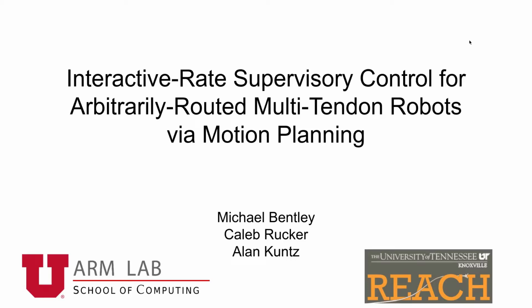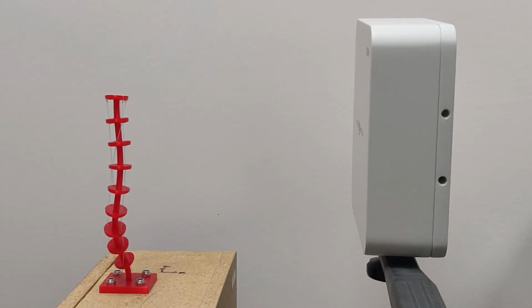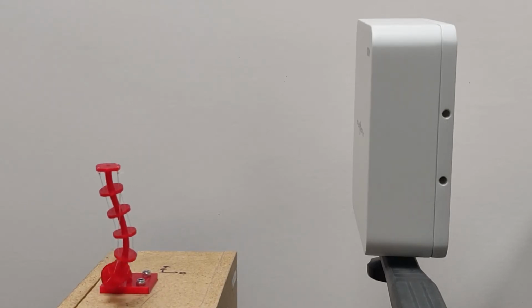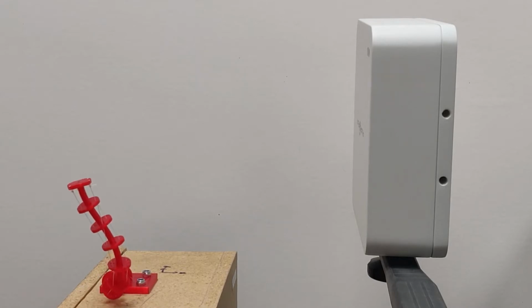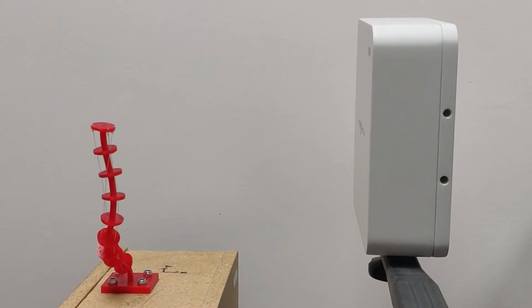This work is interactive rate supervisory control for arbitrarily routed multi-tendon robots via motion planning. This is a tendon-driven robot, a promising type of continuum robot. Tendon-driven robots have a flexible backbone with tendons routed some distance away from the backbone. By applying tension to the tendons, we can actuate the robot. With non-straight routings, we can achieve interesting shapes, as seen here.